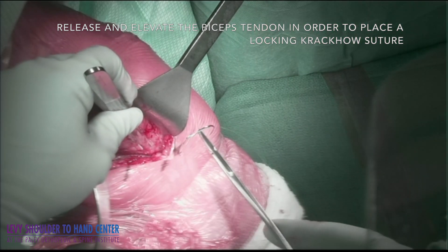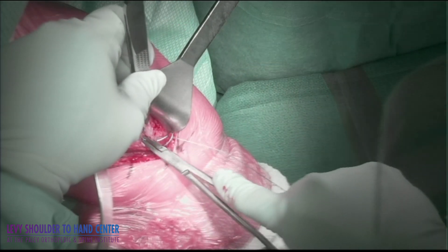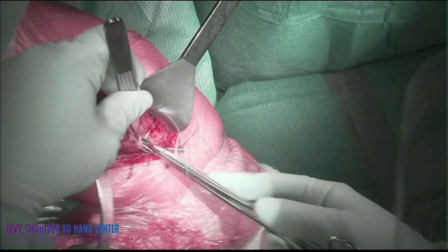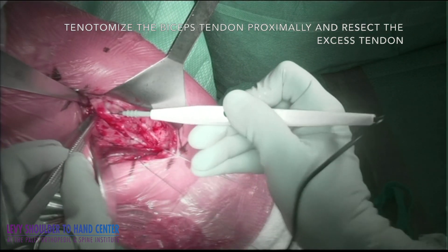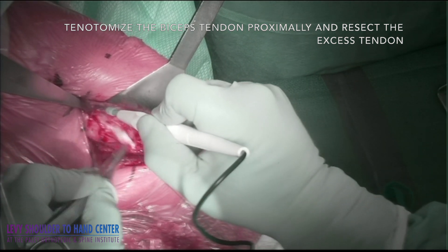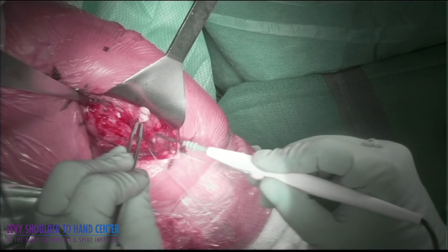I then elevate the biceps tendon and release any of the tenosynovitis from around it. I elevate the tendon and flex the elbow to allow the tendon to be brought up proximally, and place a locking Krakow suture from distal to proximal, leaving the suture end proximally. I open the rotator cuff interval and release the tendon from within the joint and resect everything up to the edge of the suture.